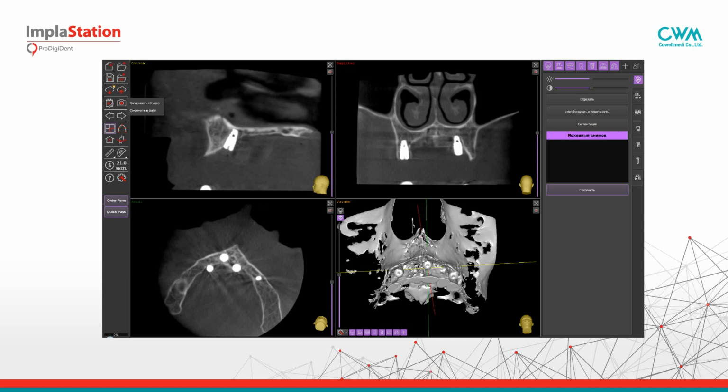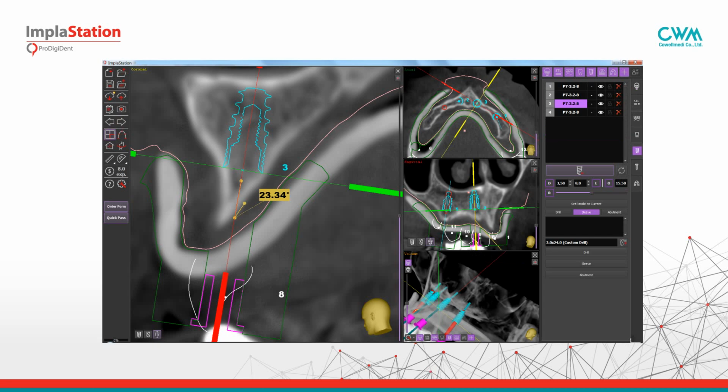The sharp edge of the ridge was not flattened. The drilling was supposed to be done at a very sharp angle to the cortical bone, and it was easier for the drill to slip along the hard cortical bone than to penetrate it.